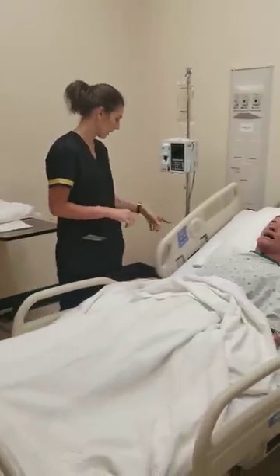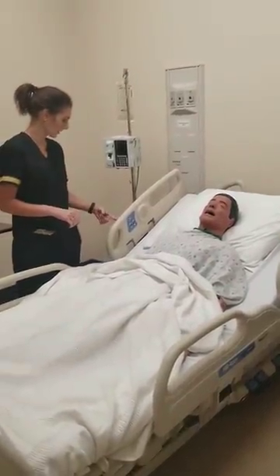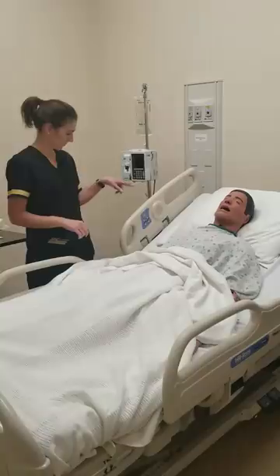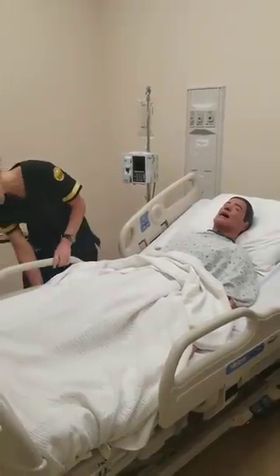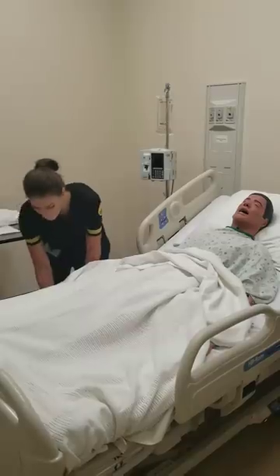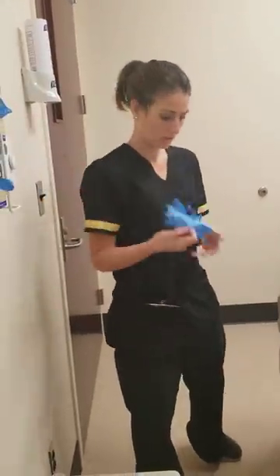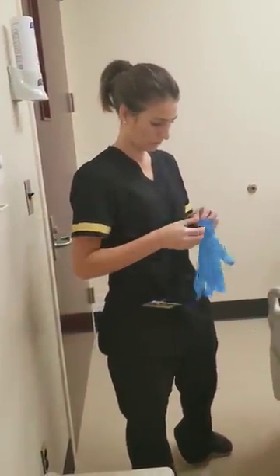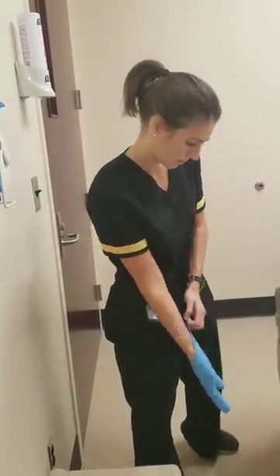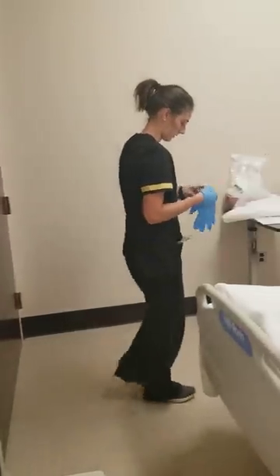I'm going to go ahead and remove the catheter. I'm just going to raise your bed to a comfortable working height, and lower the side rails. I'm going to go ahead and get some gloves on. Did you have any problems during the night, or did everything go good? Good.